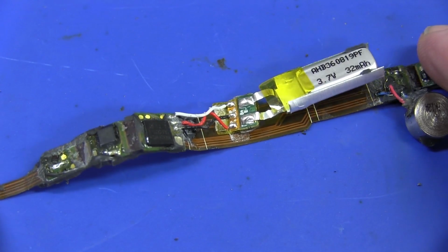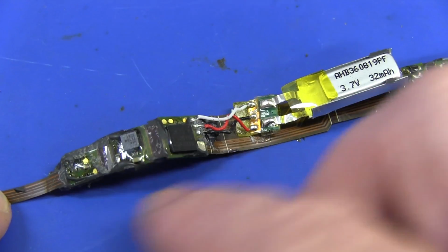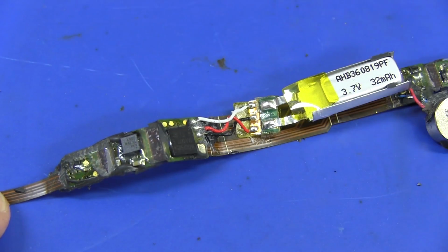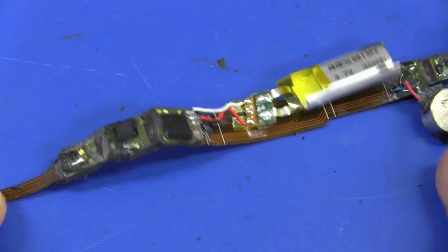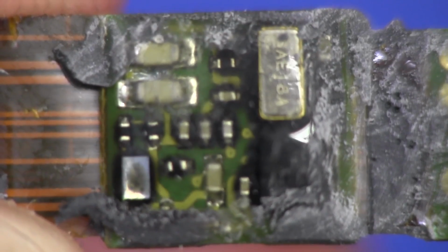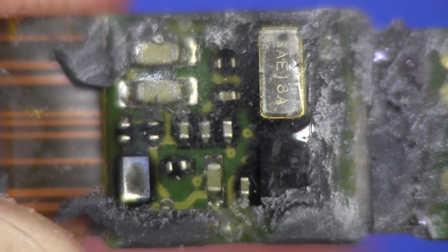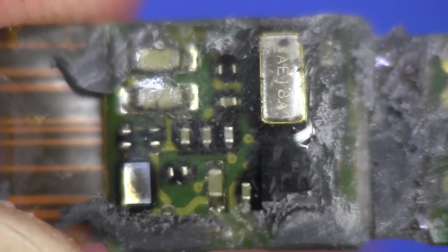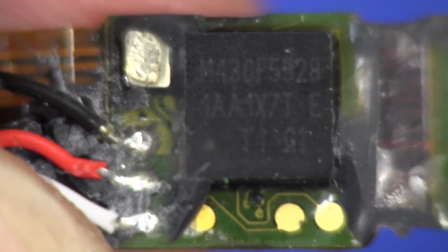I'm not sure I would have gone to all that effort, and because it's all rubberized and conformally coated, and the battery was all potted up and everything else, then sealed, this thing would be completely waterproof as well, I'm sure. And there you go, you can see the bottom of the processor board there. You can see the crystal oscillator, few passive parts and stuff like that. This would really be a pain in the ass to assemble. The processor is on the top part. There you go, there's the MSP 430 again.